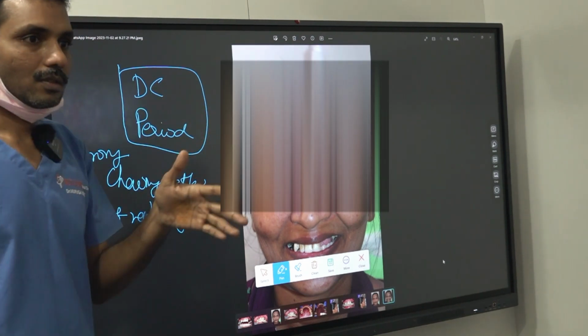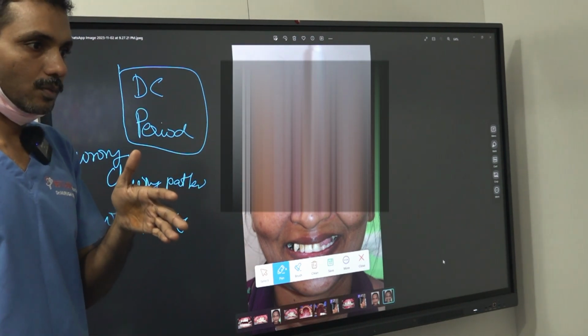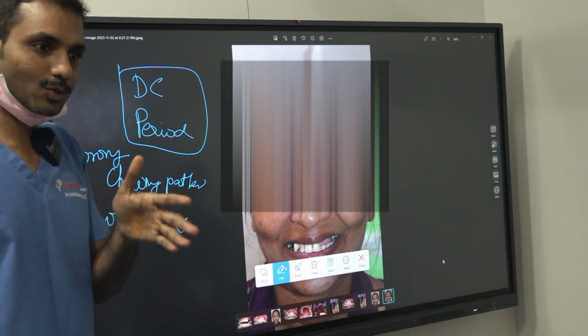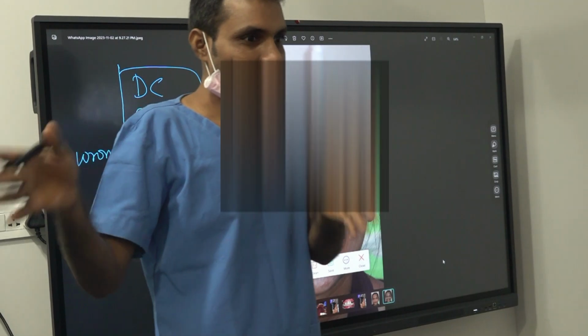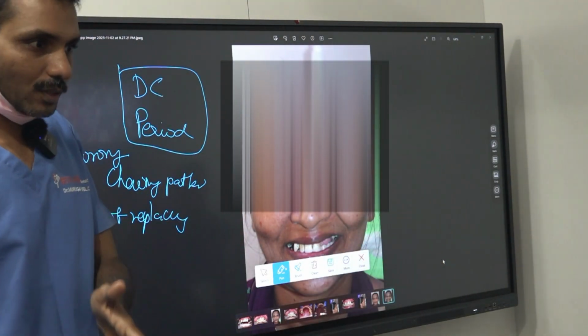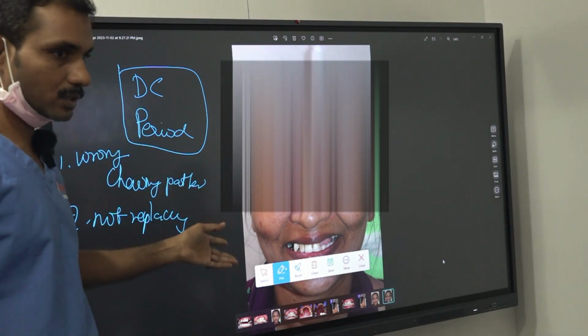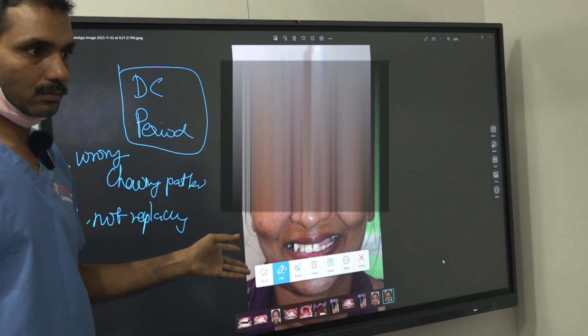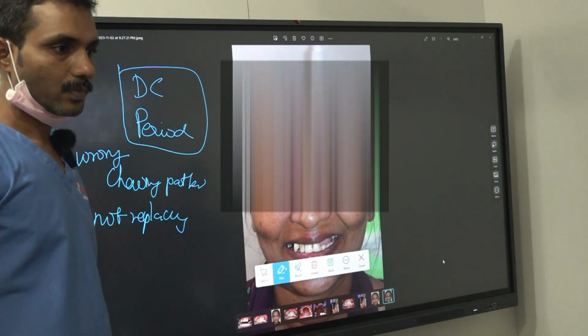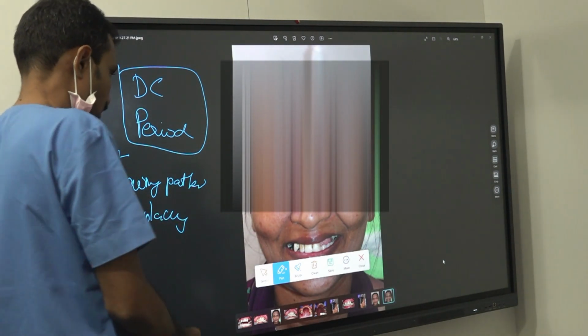That means, at this age, edentulousness is coming soon. It is not edentulous, but edentulousness is going to come soon. Because if she wants new good teeth with good treatment with long-term success, we have to extract all the poor prognosis teeth.